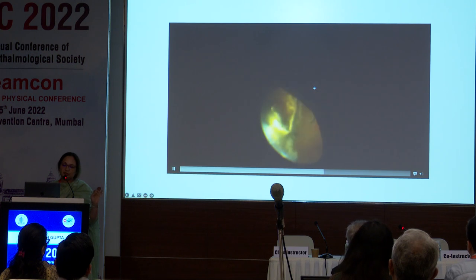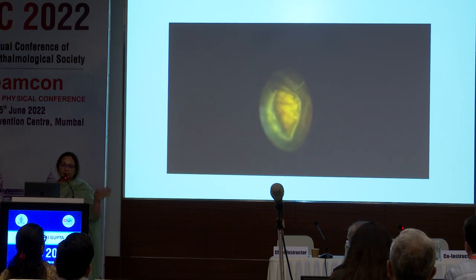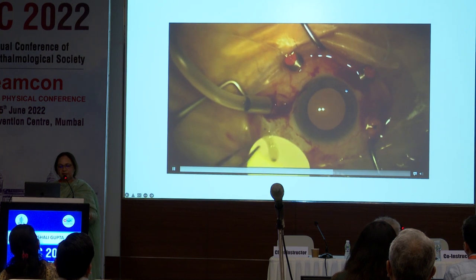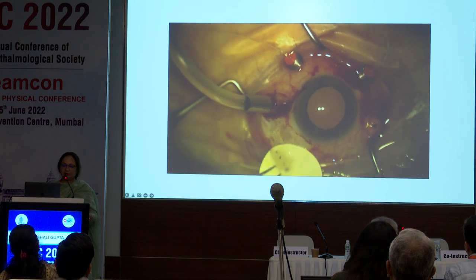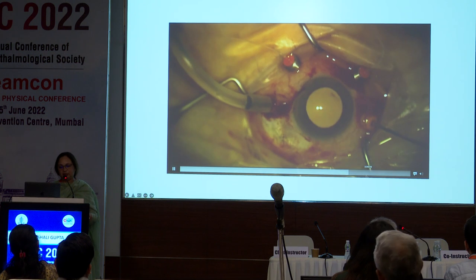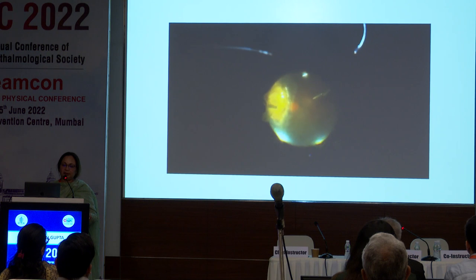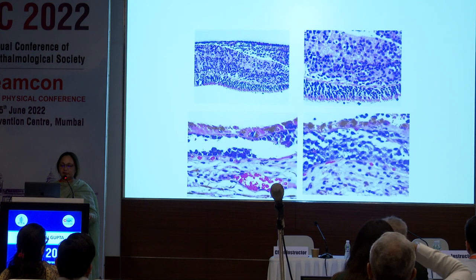Watch under the microscope that you have got it. You don't want another one. And of course, the rest is the usual fluid gas exchange and everything. And the sample, of course, has to be preserved immediately, sent to the lab, and treated with loads of respect.